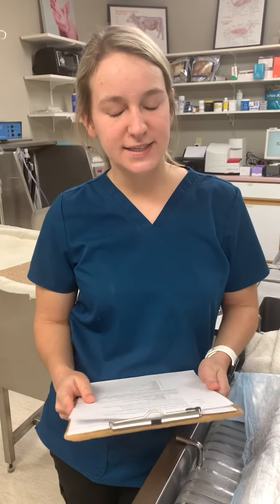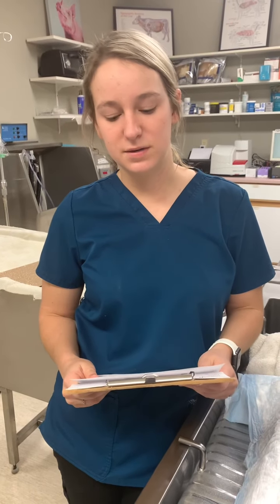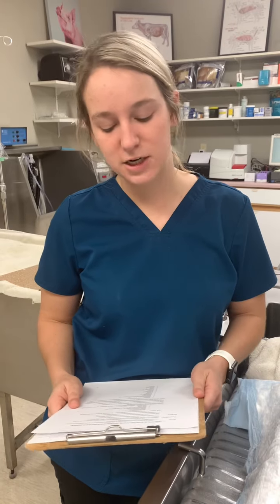This is Destiny Ulrich, and today I'm going to be assisting my DVM in prosection of a non-preserved animal for necropsy procedures. So I have our patient here.